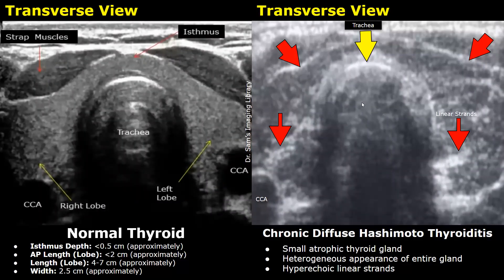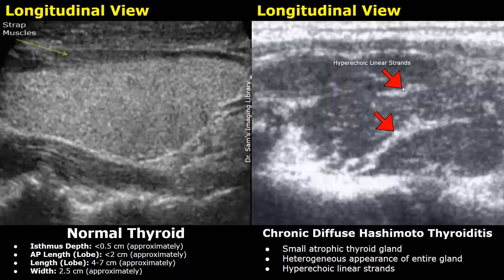In chronic cases of Hashimoto thyroiditis, the thyroid shrinks in size and has a heterogeneous appearance. The hyperechoic linear strands are more prominent in chronic stages. In this longitudinal view, you can see various hyperechoic strands. In chronic Hashimoto thyroiditis, the size of the thyroid decreases and the gland may become avascular on color Doppler.